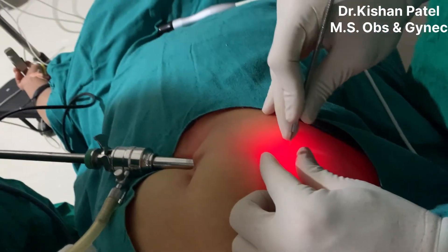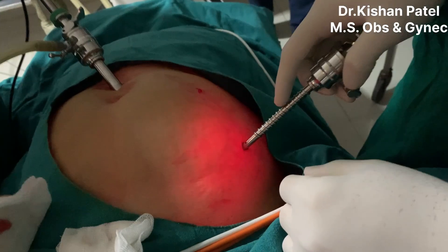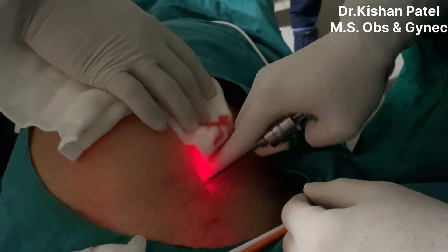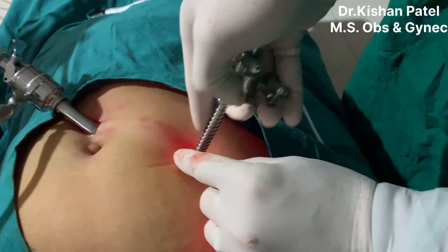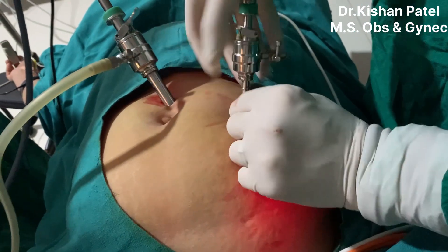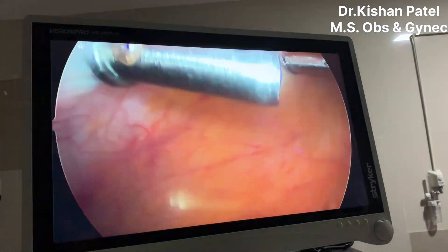The second port is also a 5mm incision, placed four fingers upward along the line joining the first minor port and the main supraumbilical port. We are giving two minor ports, and we usually complete the procedure with two minor ports and one supraumbilical incision. When entering, we go in at 90 degrees to the abdomen and, once inside, change direction toward the pelvic cavity. You can see both ports are now in position.